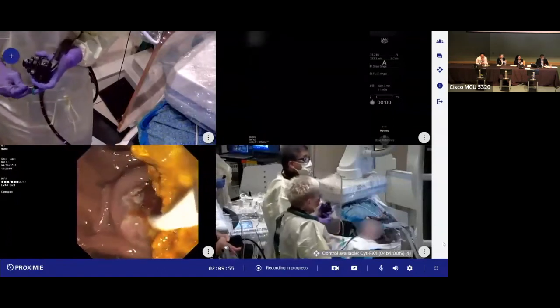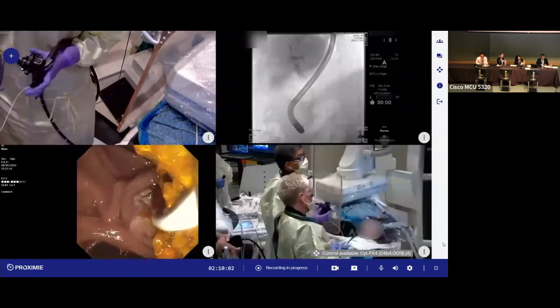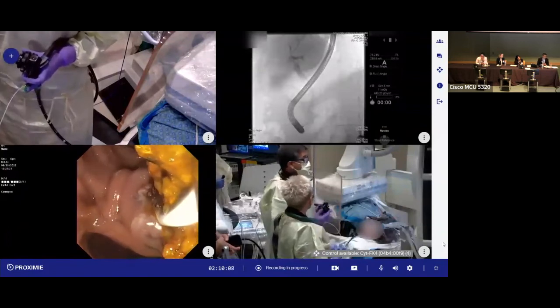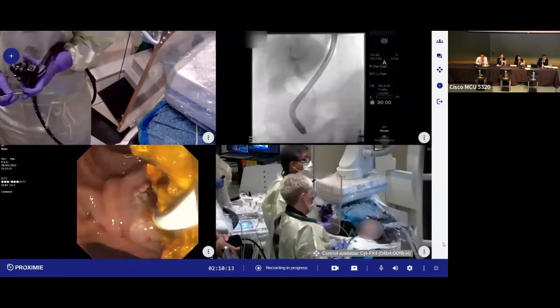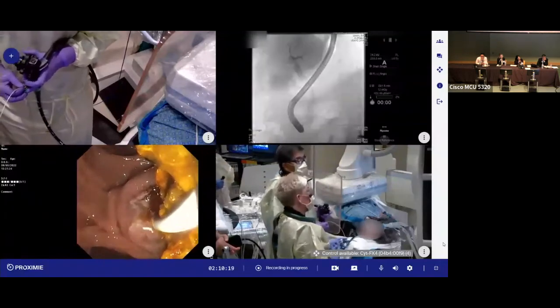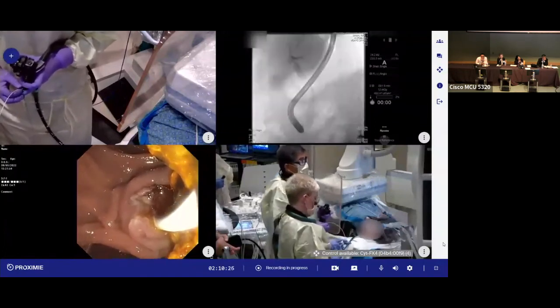Oh, well, I think it's a little bit of opinion, because I don't believe that there's any good data to suggest that you can only do a partial. I've been to meetings like this and experts will tell me that they do a max sphincterotomy and then balloon dilate. I kind of am like, why tempt fate? And so I tend to cut about halfway up or a little more. Go ahead and go to 9 or 10 here.